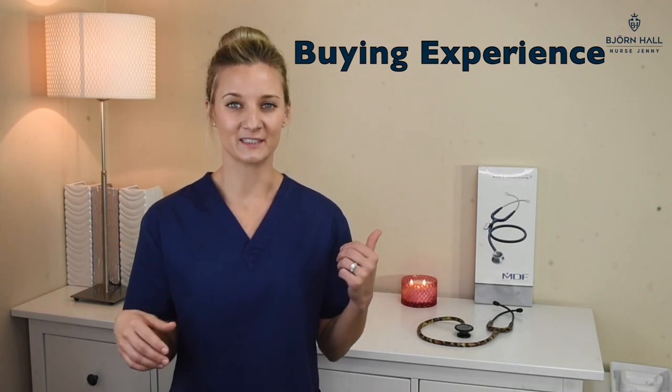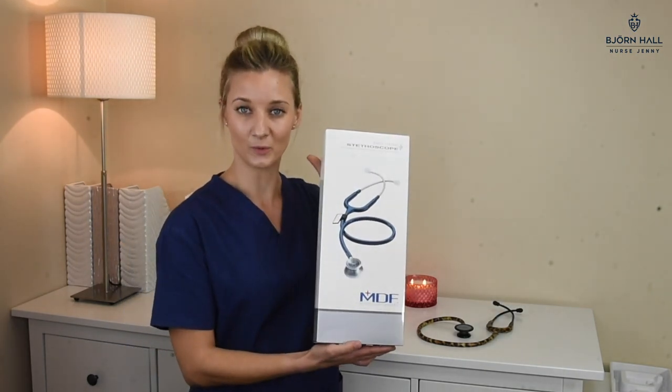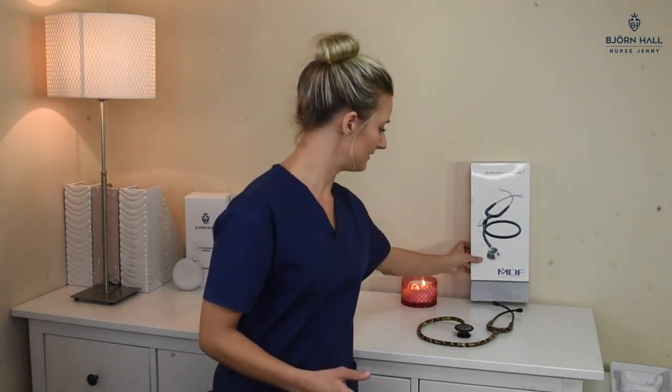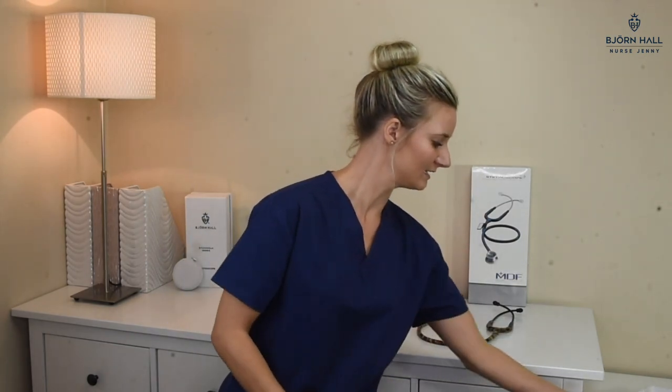For the buying experience, I received it in this box which is quite nice — it's white and displays the stethoscope nicely. It also came with a cardboard insert inside, but that doesn't impact the functionality of course. I like to include the whole buying experience when I review so you get a full feel for the product. I've given it a three and a half out of five.